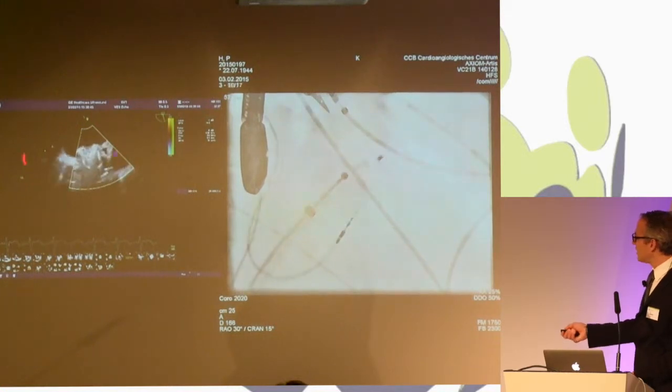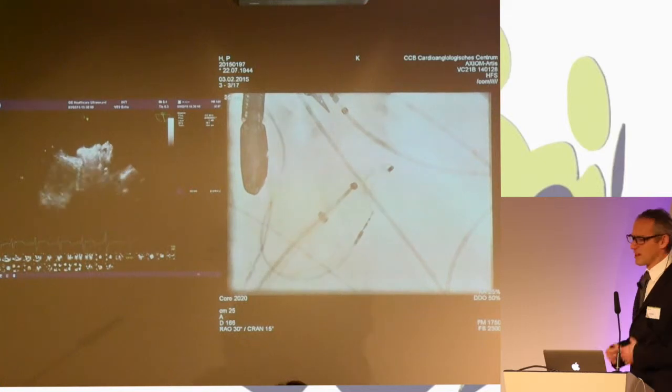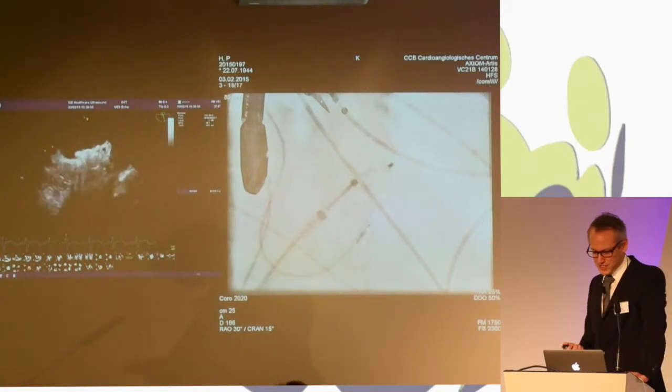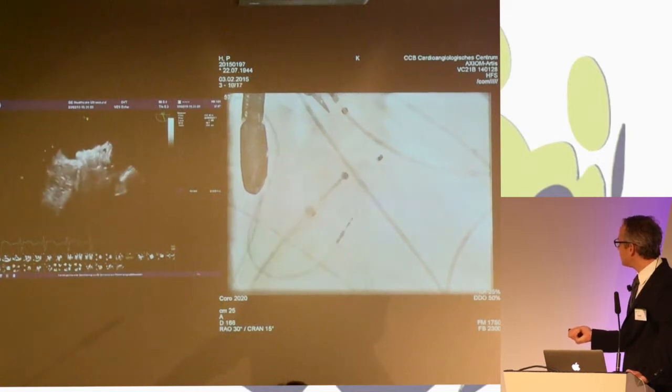We watched it a little more, and we see that the shoulder there is a shoulder, and the worst thing that can happen is that it falls out after we release it. So we thought, oh, come on, that was the first attempt, let's do it again. And this is shown now in a few seconds.